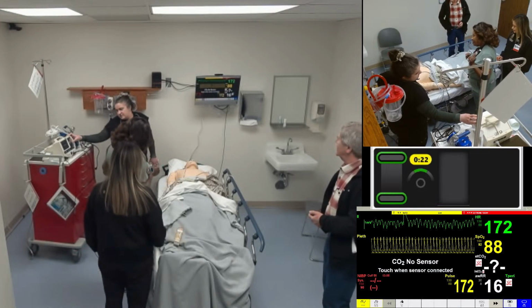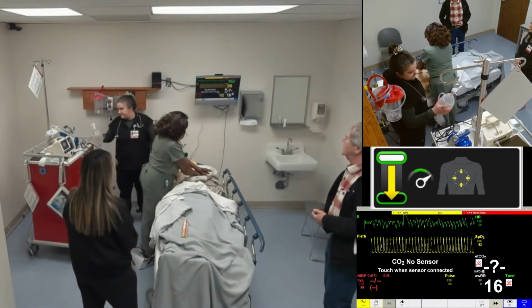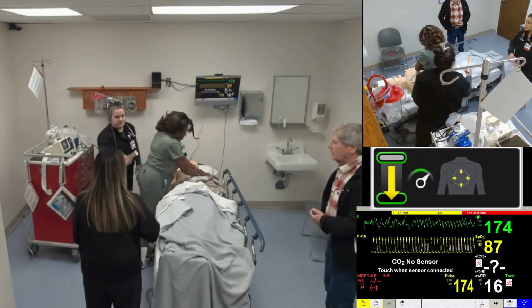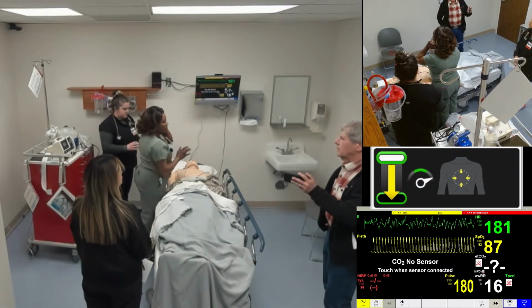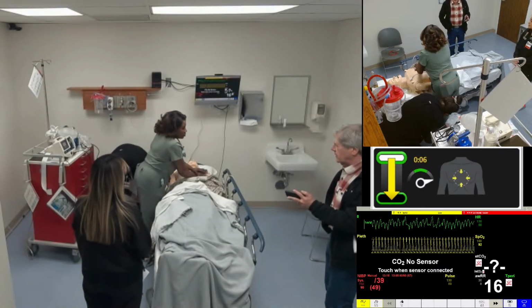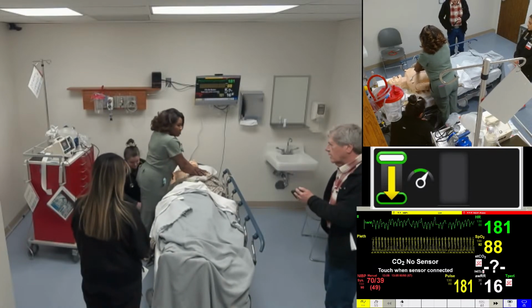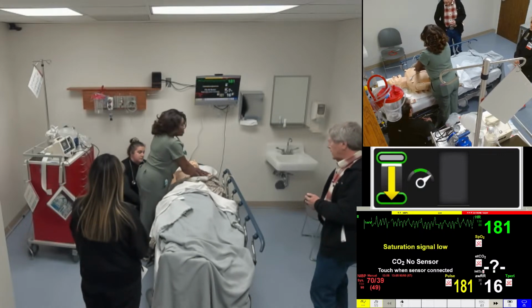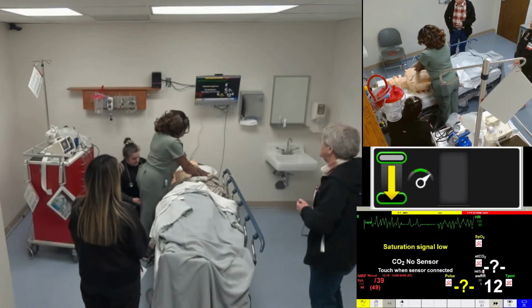Okay, we shocked again. Alright, so resume compressions for 2 minutes, and then we're gonna do 1 epi. Good job. Do we actually have to draw off the epi? You don't have to draw it, we'll just pretend. Okay. You shocked, the second shock, you're still in ventricular, VFib, VTAC. So you're gonna give epi and circulate it for 2 minutes. Alright, so you're gonna give epi now. I'm giving the epi. Okay, epi in. Good.